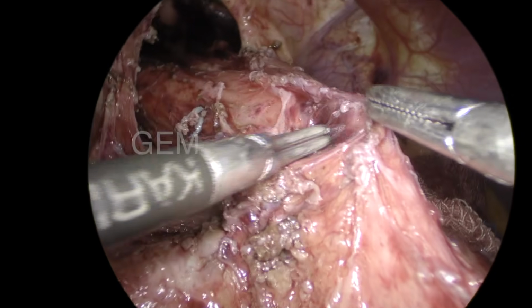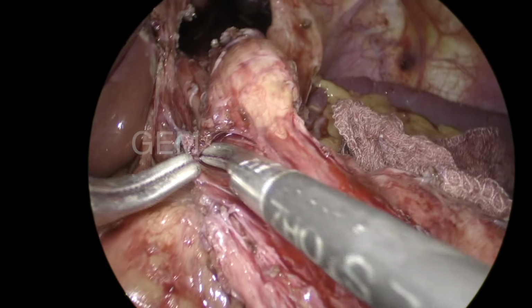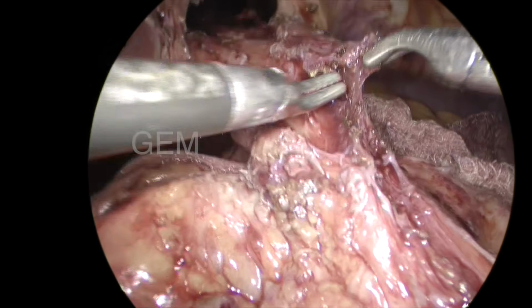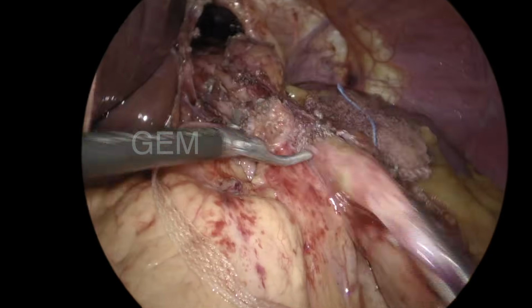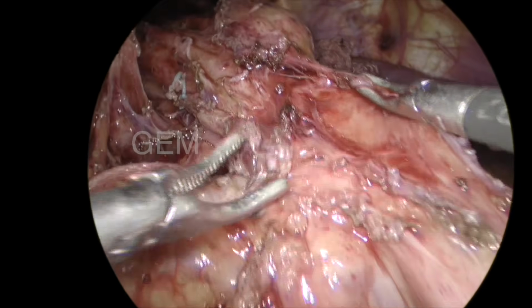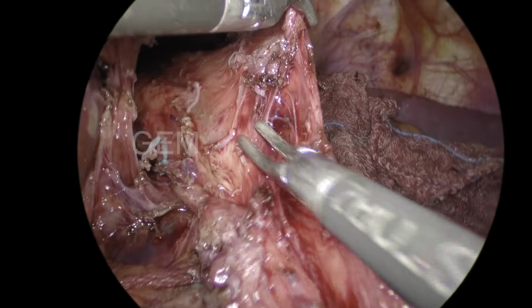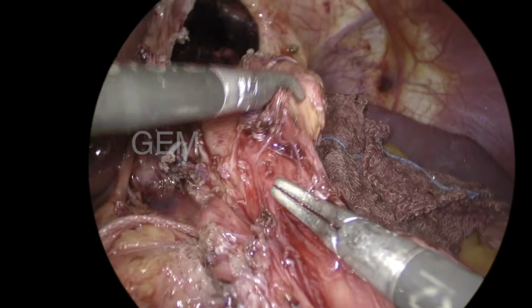I have to see whether it is a vagus nerve also. Usually, in my case, I used to separate the vagus from the esophagus, the anterior vagus, which crosses the esophagus obliquely from the left side to the right side. I thought it was the vagus, but after dissecting it, I could see it's only fibrous tissue. So that is the esophageal mucosa.